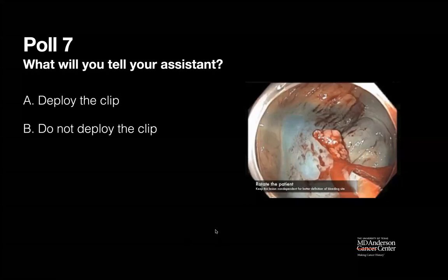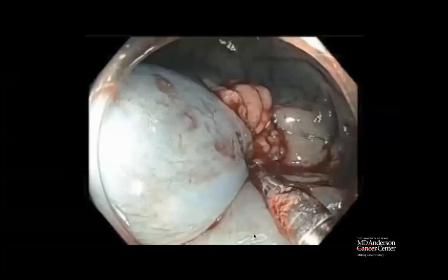So what we did here was, because there was still a lot of polyp to be cut, we applied the clip and used the tamponade for 4 to 5 minutes. By that time a thrombus will form, and the bleeding will stop for good, and then we reopen the clip, and then do whatever needs to be done.